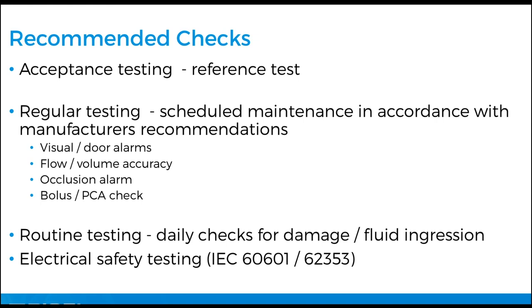So in testing of these things, I've used all different types of methods of testing in infusion, and a lot of it is awkward and cumbersome. I'm using various methods that we'll go through. And of course, if it's something like a syringe pump or a volumetric pump, then it will need an electrical safety test. As far as I'm concerned, you would use 62353 because it's a service test. 60601 is purely for manufacturing. However, your healthcare organization still might adopt the dated 60601 electrical safety protocol.